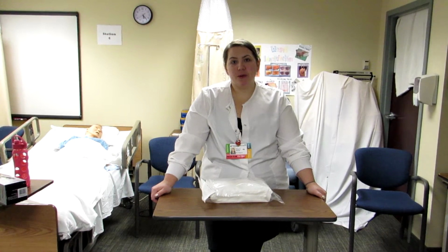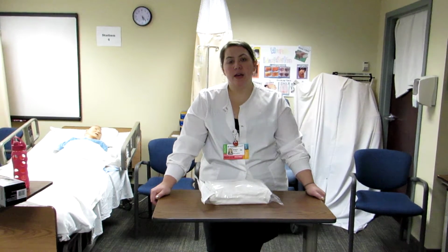So we're at video number 2 for Foley insertion. I'm going to walk you through the entire scale. My hope is that you'll use this video at home and follow along with me. Even though you don't have a mannequin at home, you can follow along with the setup and how you would insert the Foley catheter, and use this to really assist you in your test out that's coming up in a couple of weeks.